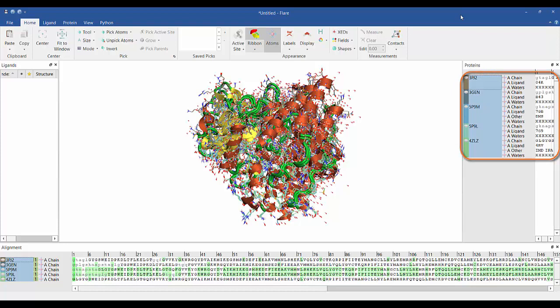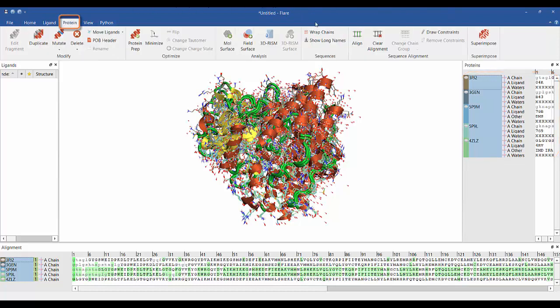They are in the same frame of reference in the 3D view; however, their residues are not aligned. We can align them by going to the protein tab and hitting the align button.